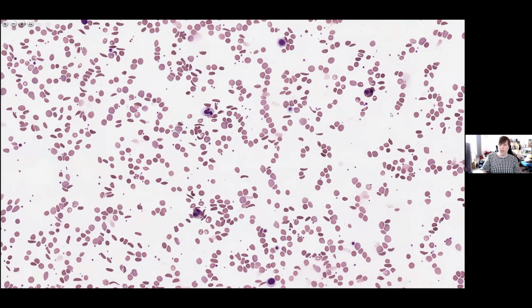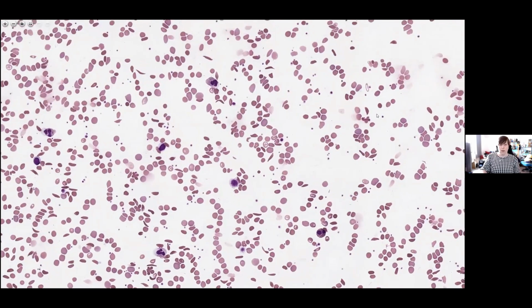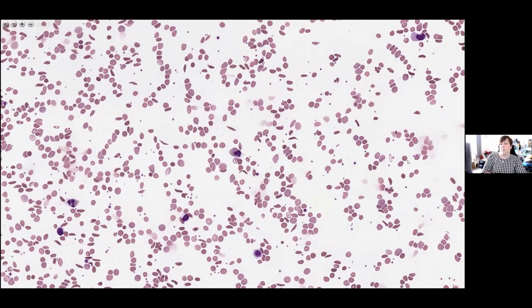Do we have any questions, I suppose, from Ali or from the comments so far? Any other comments? We haven't got any questions as such, but I'm sure they'll be coming in. I think most people agree that this is sickle cell disease. They've also commented on active hemolysis, which I think is an important thing, and features of asplenism.